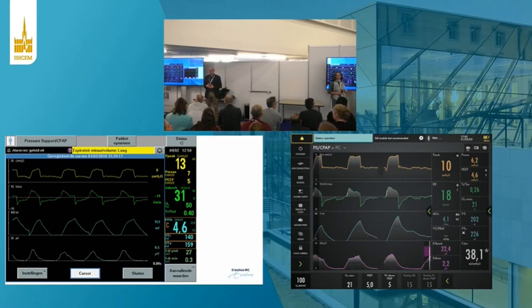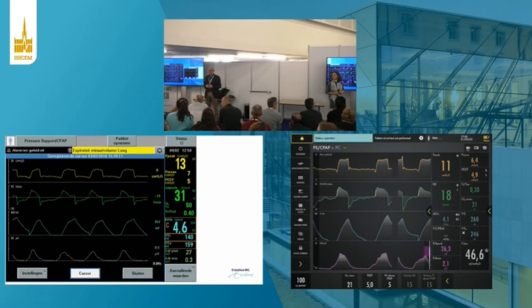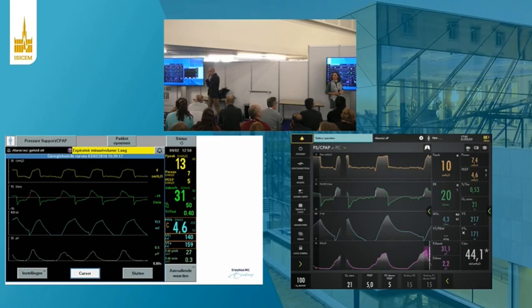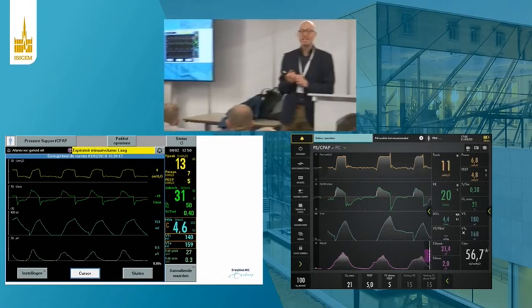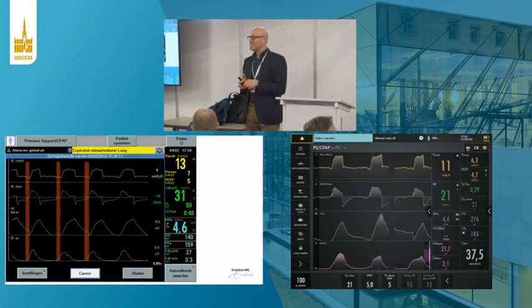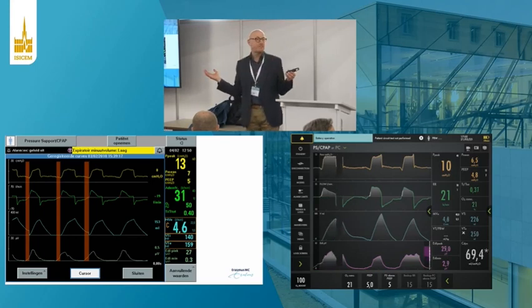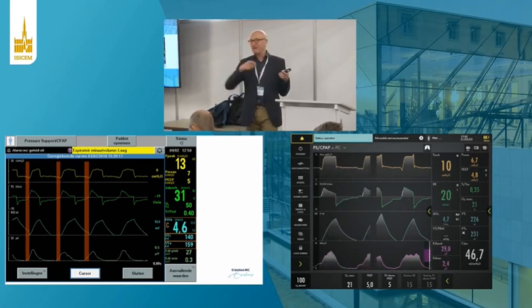You have air trapping. And sometimes you have a too long inspiratory time. Have this electrical activity of the diaphragm. Microphone, okay?